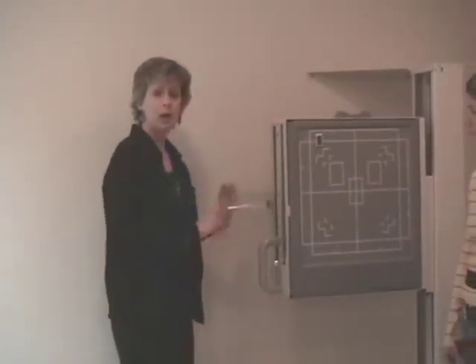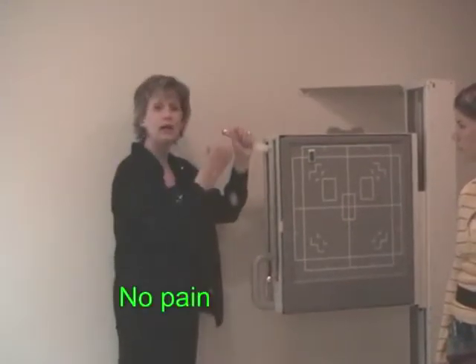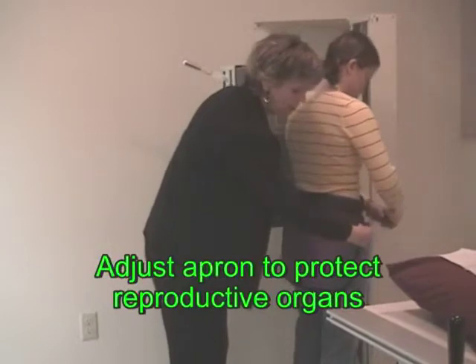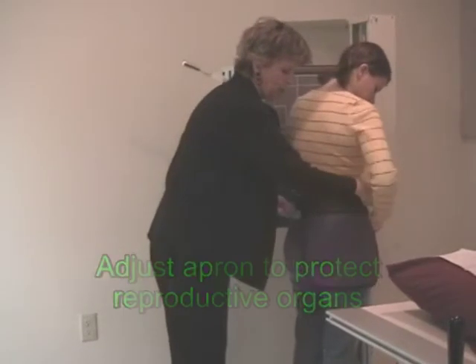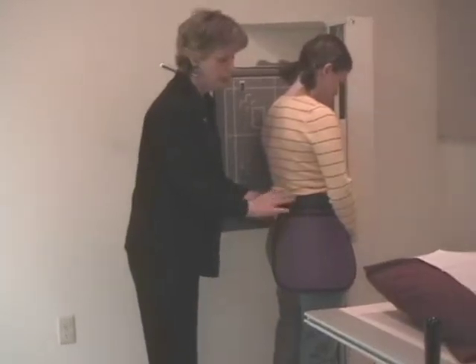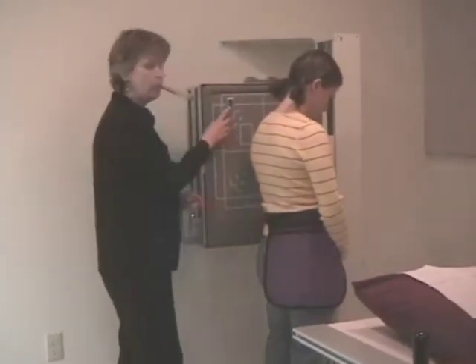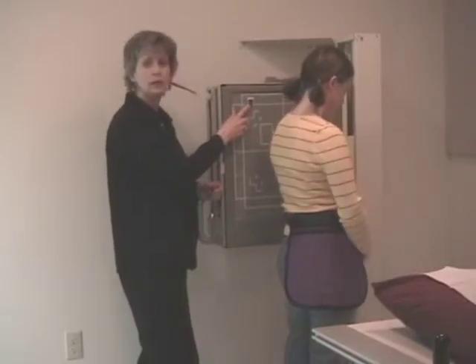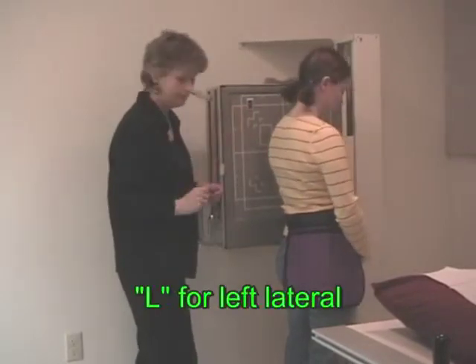And if you will recall, the patient did not have pain on either side specifically. If I don't move this apron, I am not protecting her reproductive organs from the X-ray exposure. So I need to do that. The L marker is just fine where it's at because we're doing a left lateral. Okay?